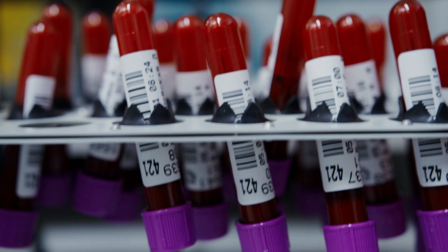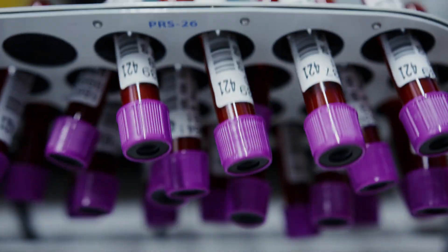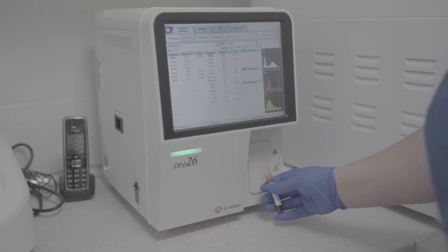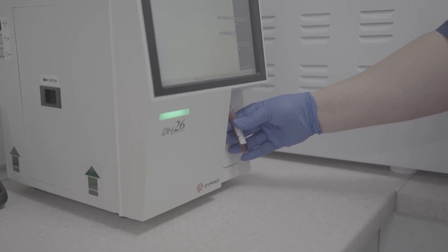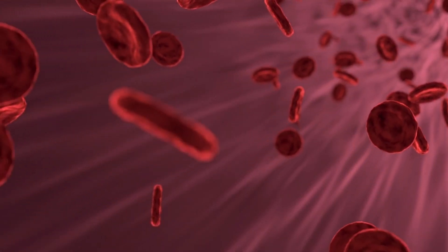Next up, the purple or lavender tube. This one has EDTA, and if you're in the lab, you know this tube is the king of haematology. We use it for CBC, ESR, HbA1c, and more. EDTA prevents clotting and keeps blood cells in good condition for counting under the machine.